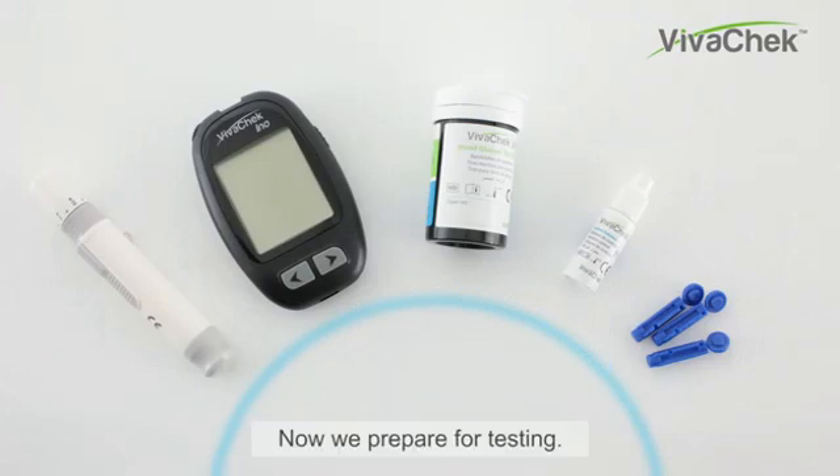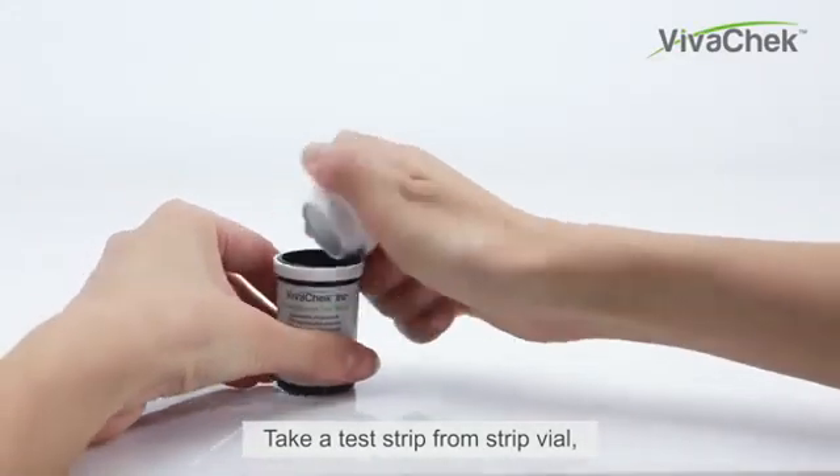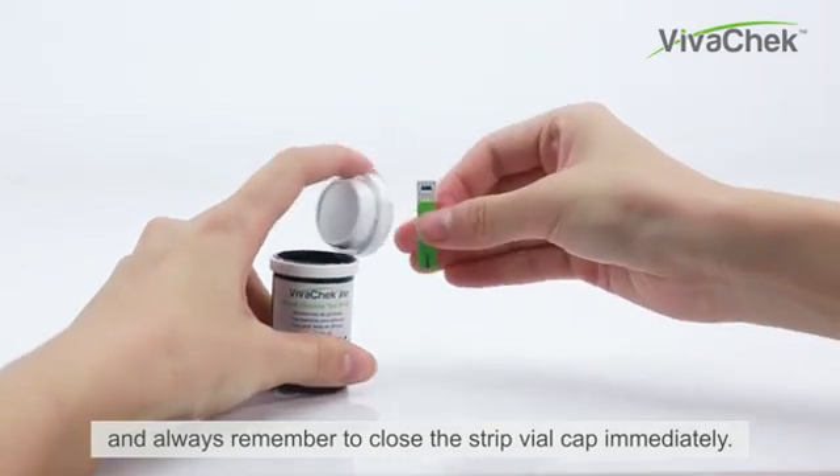Now we prepare for testing. Wash and dry your hands well before testing. Take a test strip from the strip vial and always remember to close the strip vial cap immediately.